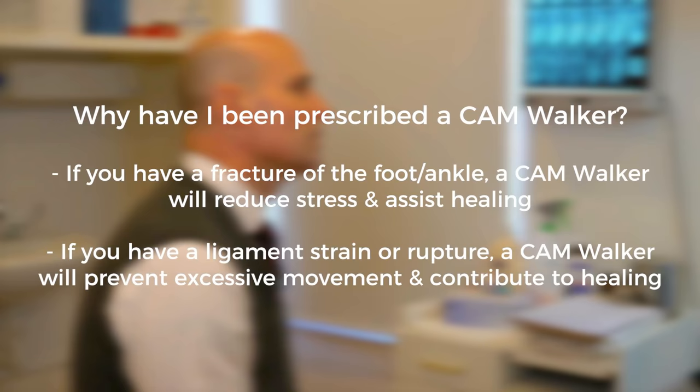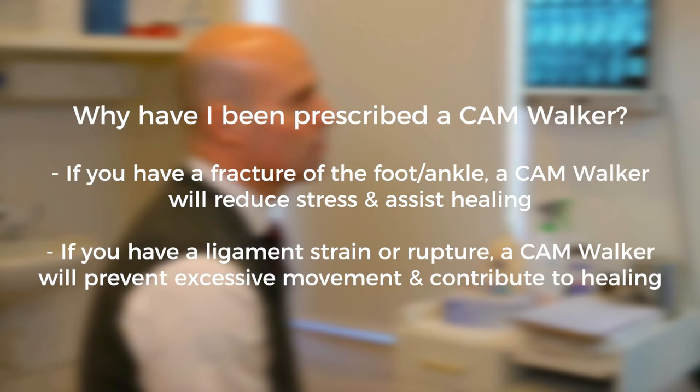Why have I been prescribed a CAM walker or moon boot? For fractures: if you have a fracture of the foot or ankle, it will prevent movement and reduce stress applied to the fractured bone during healing.